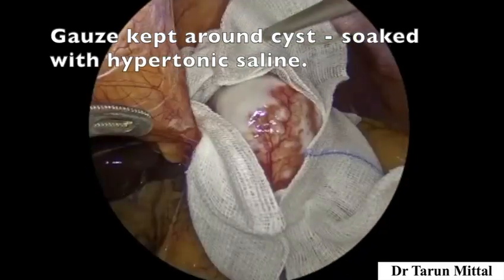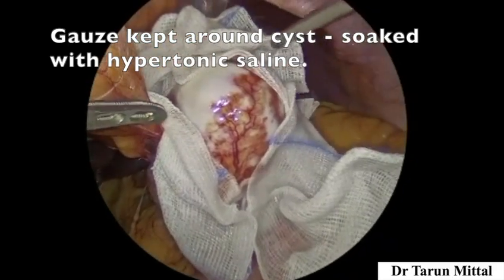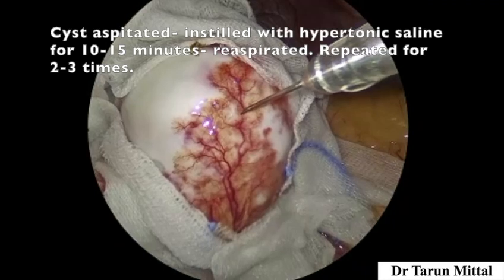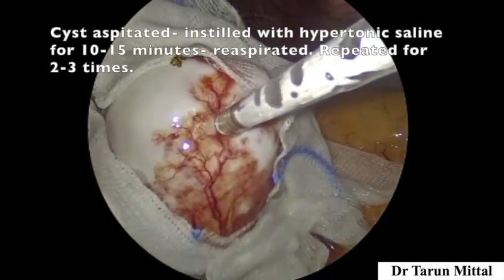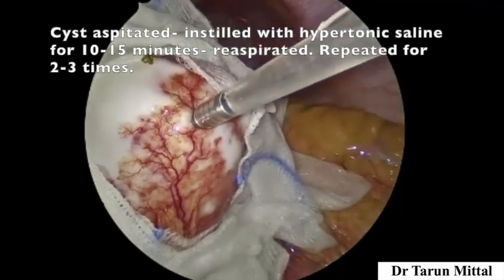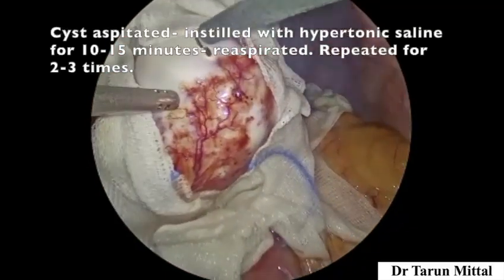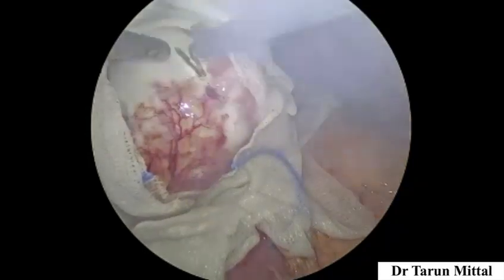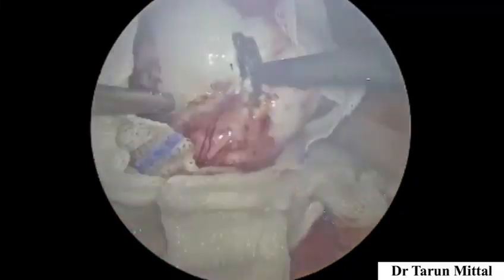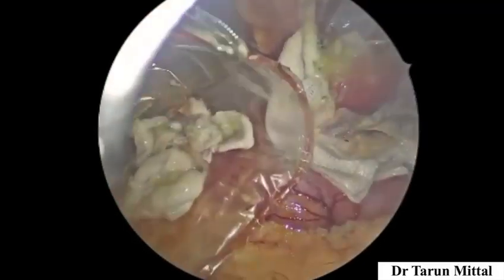Now we have instilled hypertonic saline around this area, and now we will aspirate the cyst, and then instill hypertonic saline 10 to 20% and keep it for approximately 15 minutes, and we can repeat this 2 to 3 times. After this step, we incise the ectocyst, and with the help of the hook, and we should keep the endobag right beside, so that we can put all the germinal membrane, the cyst and the scolices into the endobag.